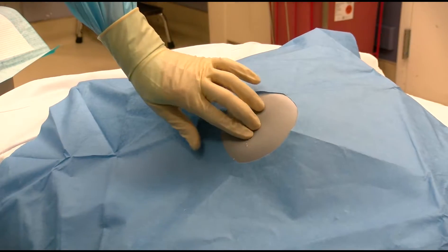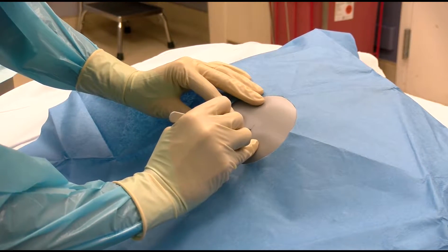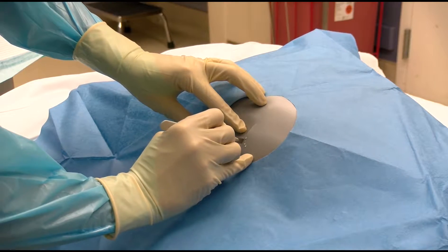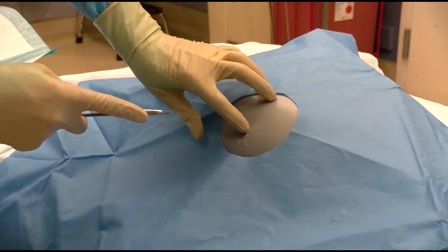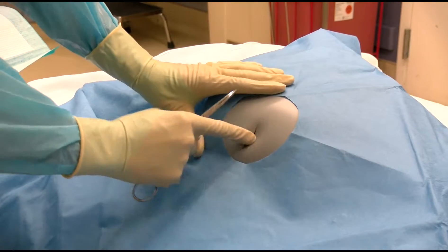After the lidocaine has been able to take effect, make a 3-centimeter incision through the skin and into the subcutaneous tissue at the previously selected site. Use blunt dissection to identify the rib and rib space with your finger and the curved hemostat.